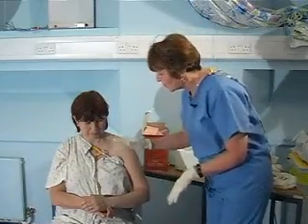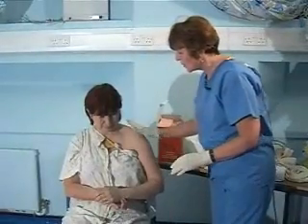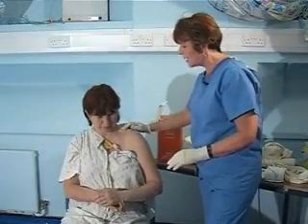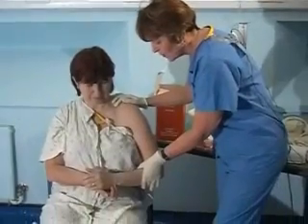First of all, we've got to prepare her because the plaster is going to make a mess. So we get appropriate clothes on and have enough clearance where we're going to put the slab, because the slab is going to come up past the shoulder.